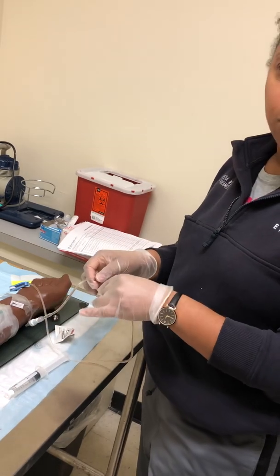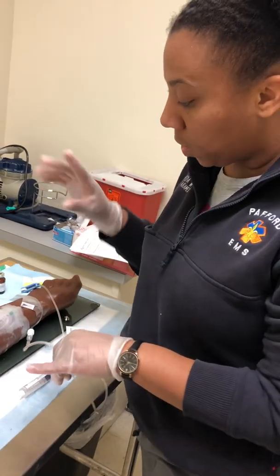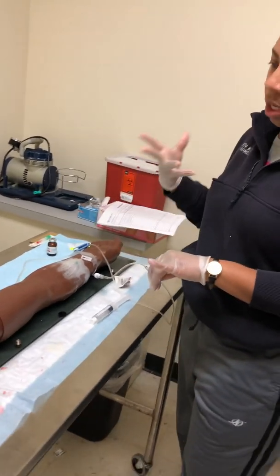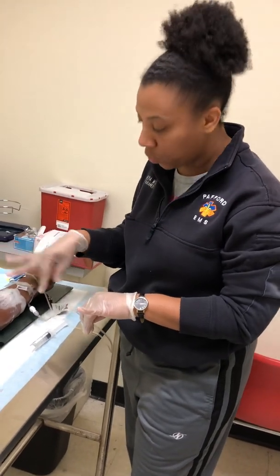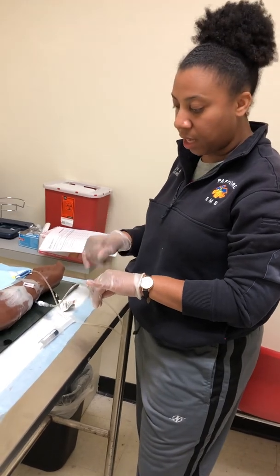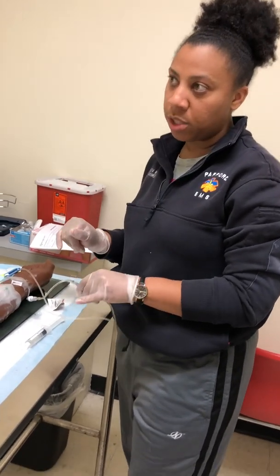And I'm going to sit here and watch the patient for a minute just to check for any allergic reactions. Continue to monitor the IV site. Once again, ask the same question. Are you feeling any tingling, any numbness? Look for swelling, leakage, any type of redness or anything like that. I would, like I said, sit here and watch the patient for a minute.